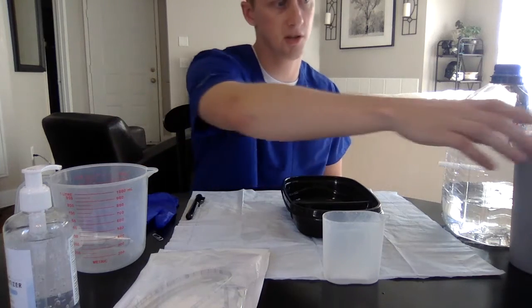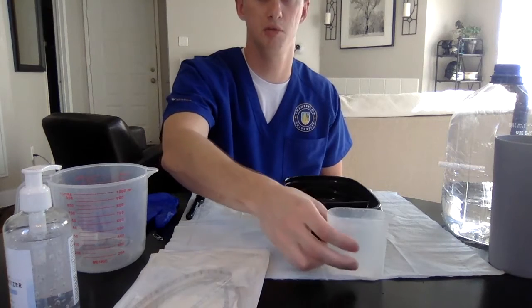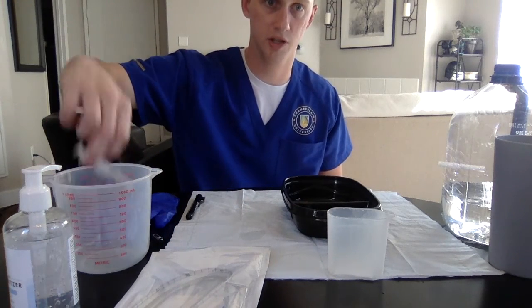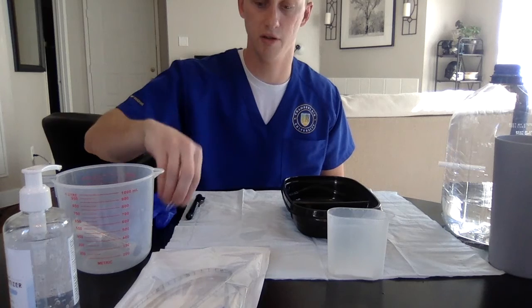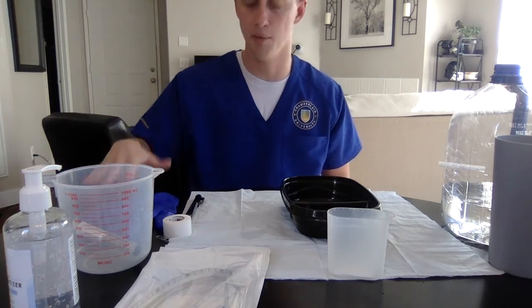We have our emesis basin, our water cup our client will be drinking from. Our pH paper is going to be in here. We have our tubing. I have my syringe in here, which we're going to pretend is the big one. I have my paper clip with no rubber bands, so we're just going to verbalize that. I have my pen light and my tape, and my gloves over here too.